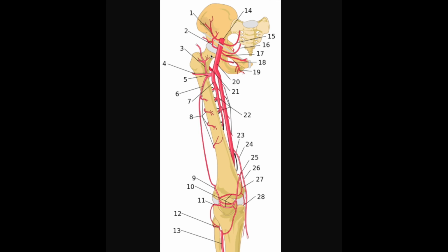And that's always, at the very least, there's a theoretical risk that some thrombin can go into the artery. And the expectation is that even if you get a tiny amount of thrombin into the artery, because this femoral artery is going to be a lot higher flow than a pseudoaneurysm, which is the outpouching that you get the classic yin-yang sign on ultrasound, and so blood coming in and coming out. So within the pseudoaneurysm, you're more prone, which is what we want, to cause thrombosis. While if you have some thrombin in the femoral artery, at least in theory, it should wash out and it's less prone to forming thrombus.